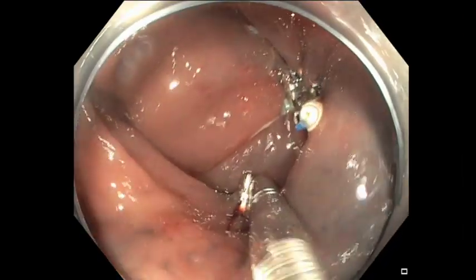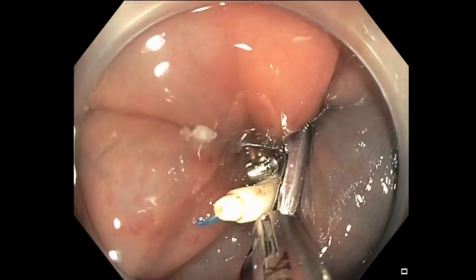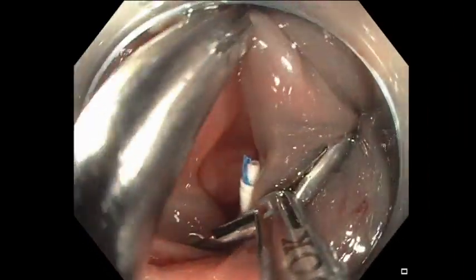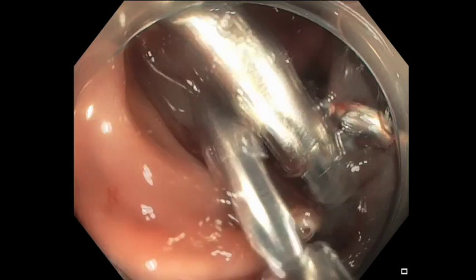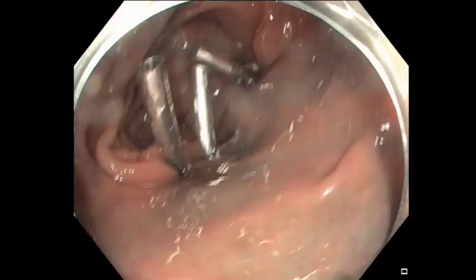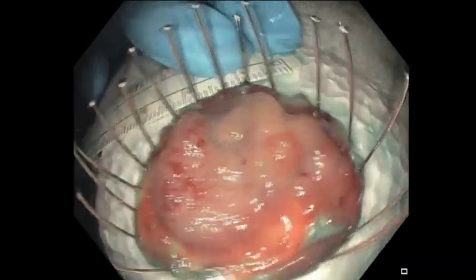I consider this system as an approximation device and not closure alone. So despite using it to close both sides like that, I'm going to put clips over it, and these clips will prevent it from opening and will ensure we're having full closure, not only approximation. I hope this video showed you a closure technique, a new closure technique, and also the gravity assisted technique. And in other videos we will show how traction can work when gravity does not work.